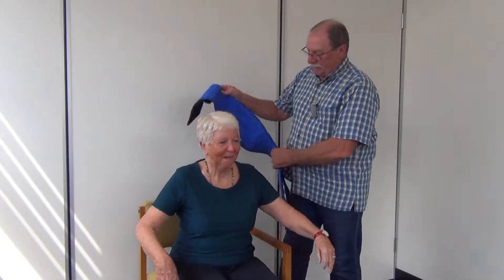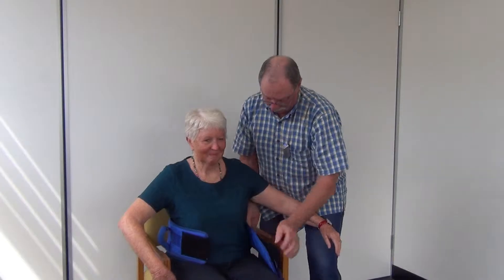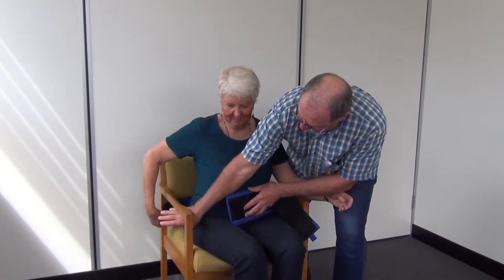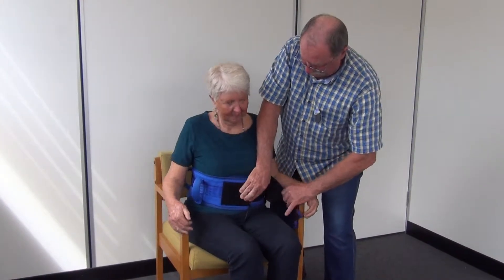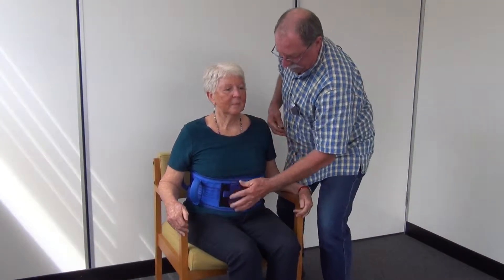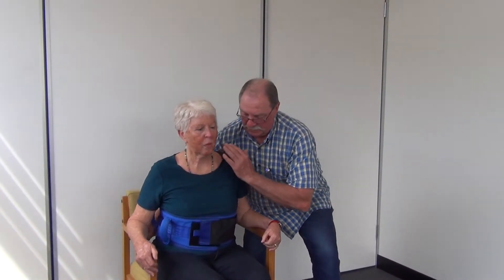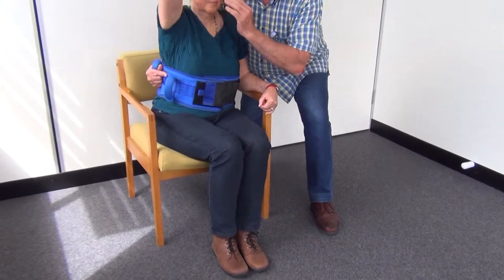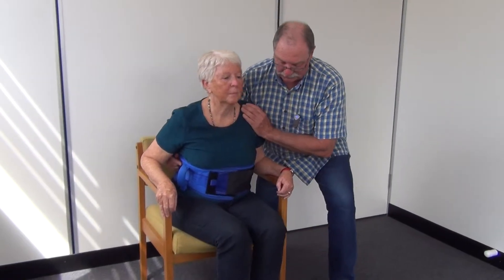We are assisting our client to stand and walk using a walking belt. We attach the walking belt around the client's waist, making it firm but not tight. We position our leg similar to before, place a hand on the shoulder, reach around and grab grip, then ask our client to wiggle to the edge of the chair.